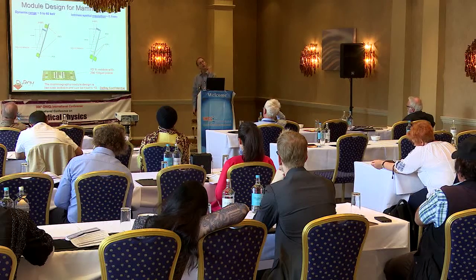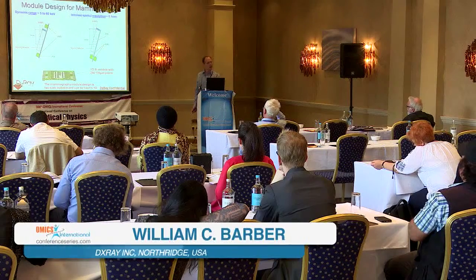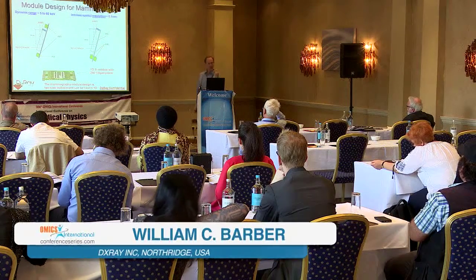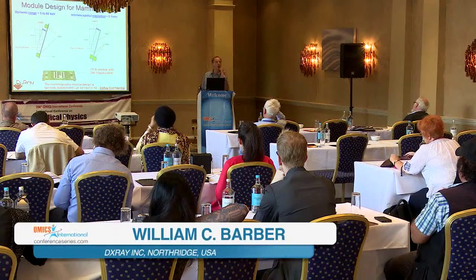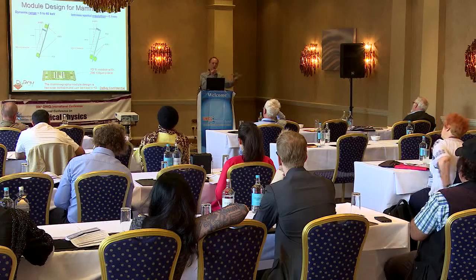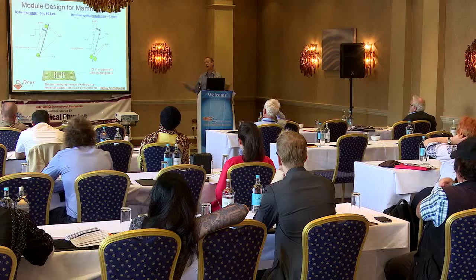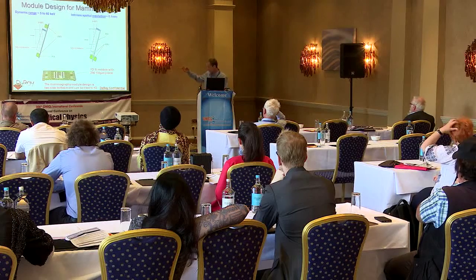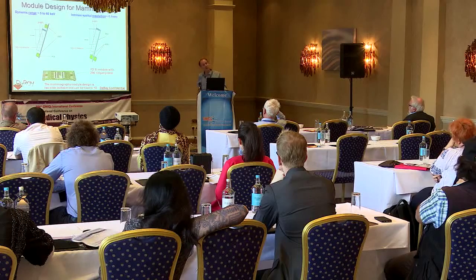But there's a problem with mammography in using cadmium telluride or cadmium zinc telluride. The pixel sizes have to be very, very small. The pixel sizes cannot be bigger than 100 microns. And the charge sharing that I showed, which produces excess tailing, means that you cannot use those materials, cadmium telluride and cadmium zinc telluride. But we can use silicon.